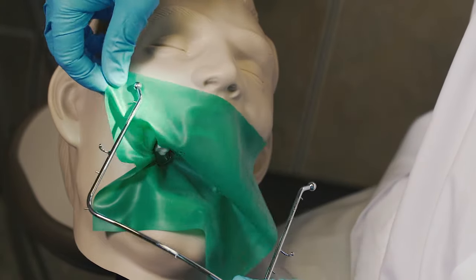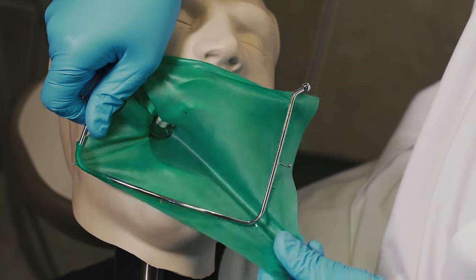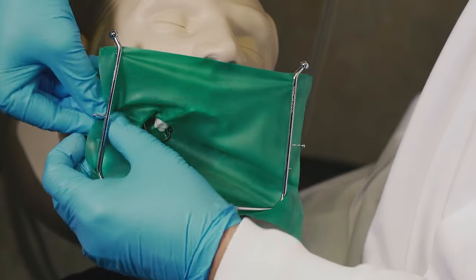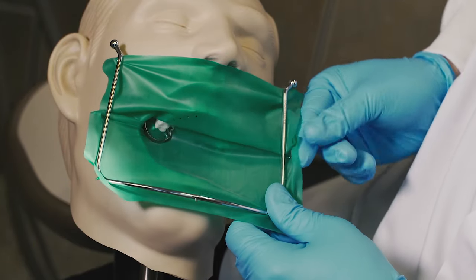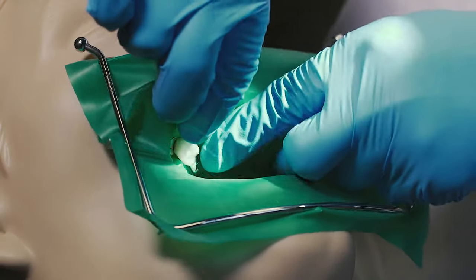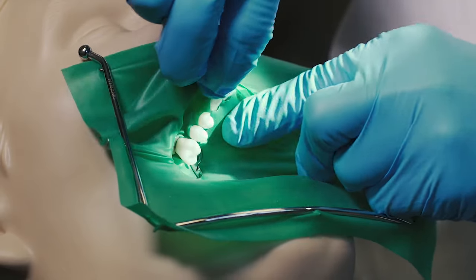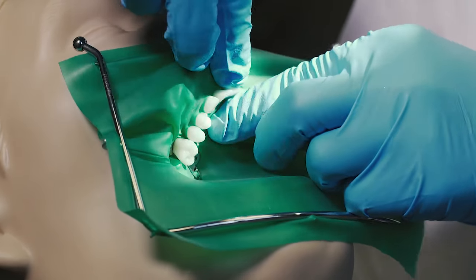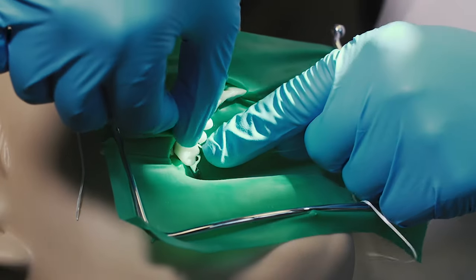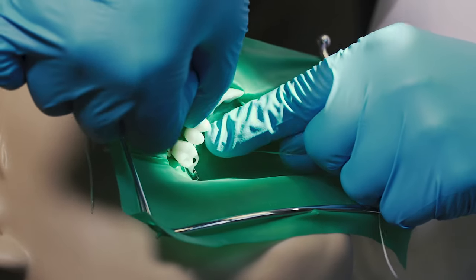The next step would be to attach the rubber dam to the rubber dam frame. The idea is that now you can get any excess of the rubber dam out of the working field and away from the patient's face as well. Our next step is now to open every perforation to every tooth that we're going to isolate. In this particular case, we're going to go all the way to the mesial aspect of the central incisor. Once the rubber dam and all the holes have been opened, we're going to use floss and push the rubber dam apically around each tooth so that it's nice and secure.